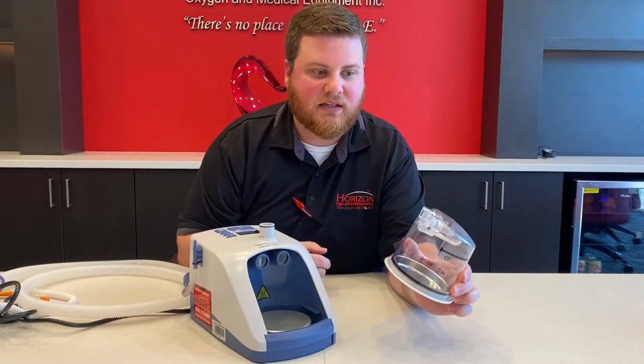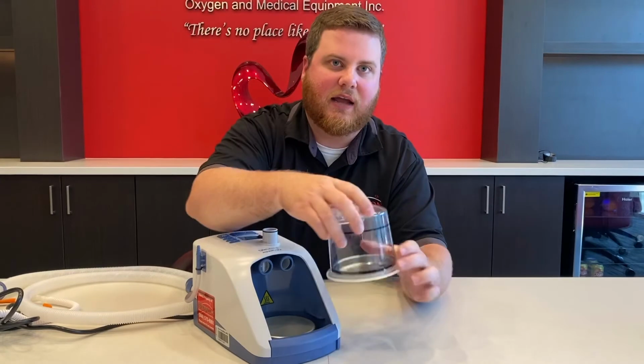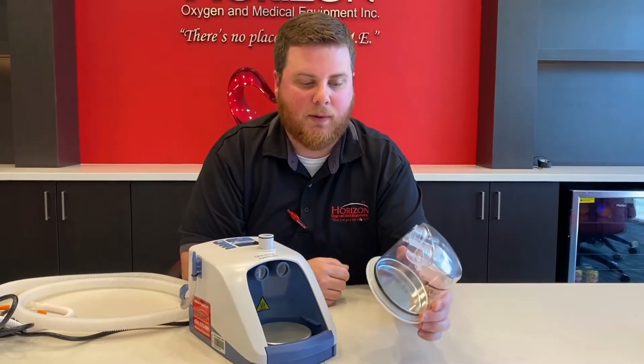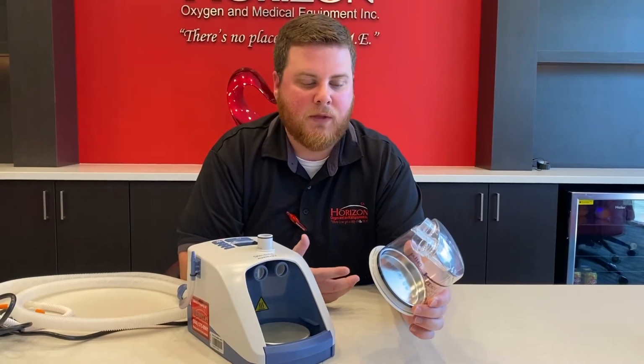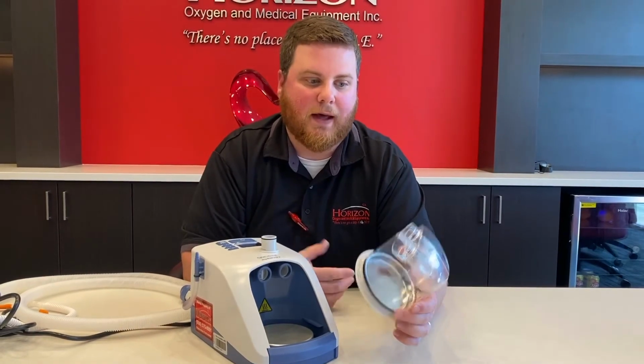So that takes a little bit of dexterity with your hands. You're gonna have to be able to hold the slide down with one finger and then slide the whole humidifier chamber out. But once you do it once or twice, it's really easy. Whenever we're setting this up, we always make sure that there's somebody there that understands how to do that.